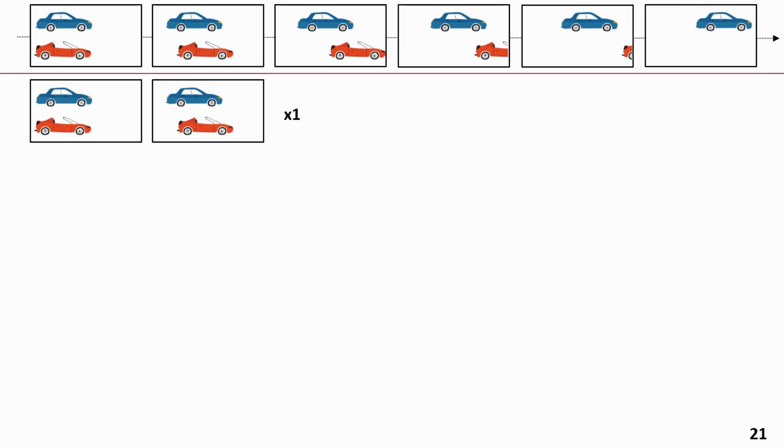Phase encoding works differently. At the top of this slide, we keep the photographs that make up the video so that we can have a reference for comparison. With phase encoding, we ask the drivers to come to the starting line and then tell them to go. We take a single photograph and that is it.